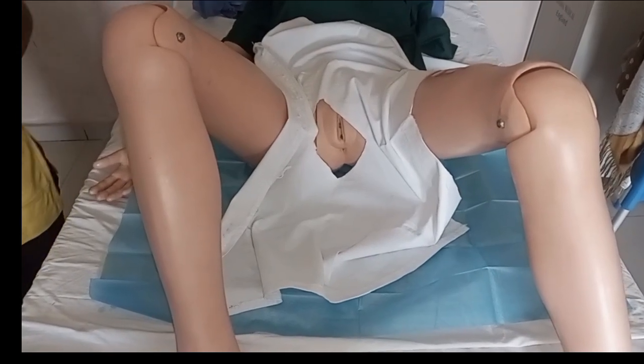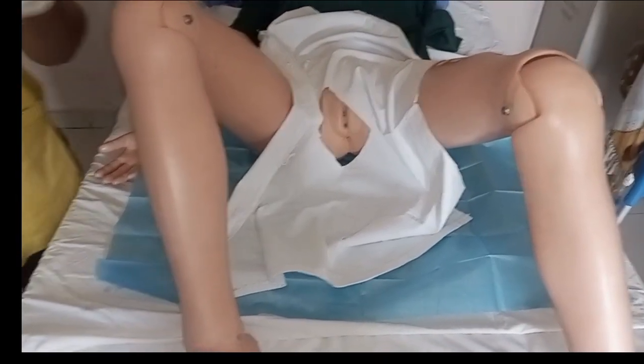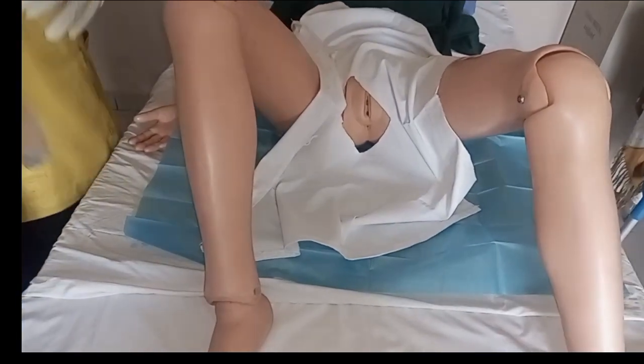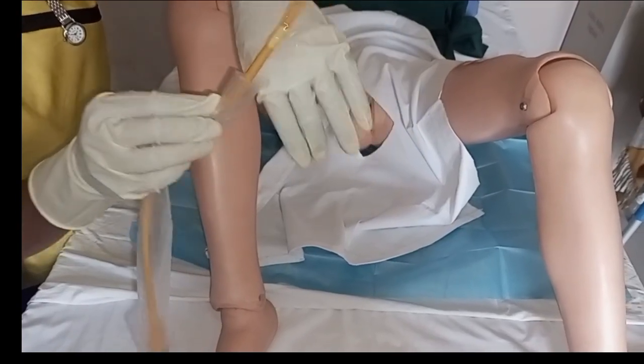Remember, during catheterization you have to change the glove after cleaning the patient's vagina, then change to another sterile glove. I have changed my gloves and placed the sterile fenestrated drapes. Now I ask my assistant — this is our catheter — remove the lid and discard it in the receiver for used swabs. Ask your assistant to drop a lubricant. I'm going to use K-Y Jelly to lubricate the catheter, paying attention not to block the eye of the catheter with the lubricant.